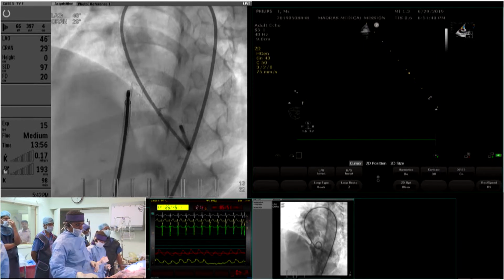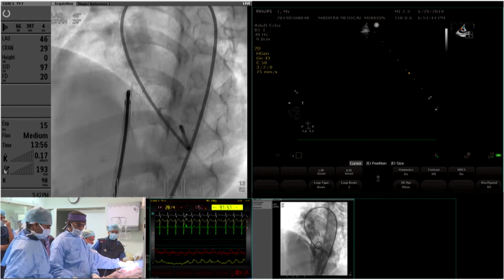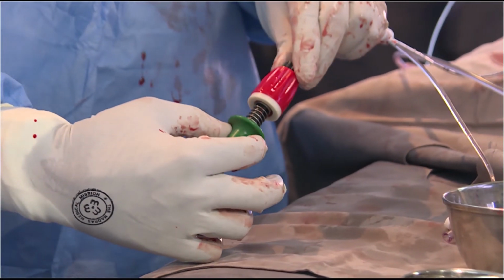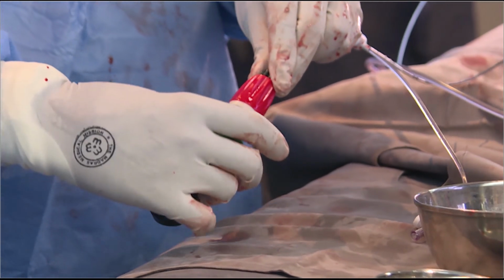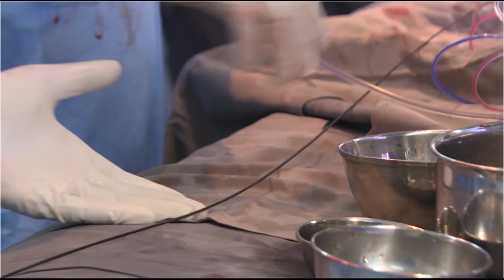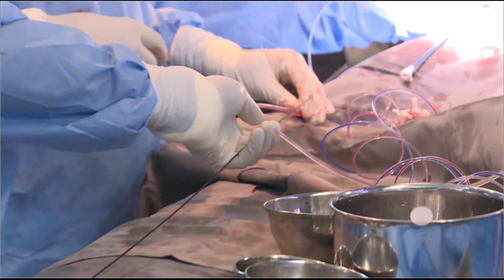The cable is still passing through the tricuspid valve. So camera here. So the mechanism of release is... I'll show. So it was released. So now we will do one final LV angiogram and then one echocardiogram. Can you get ready?